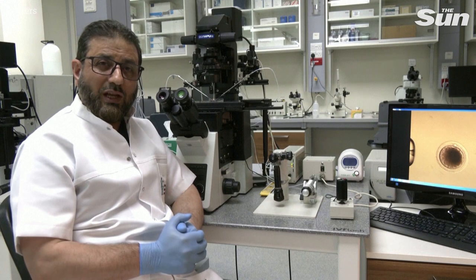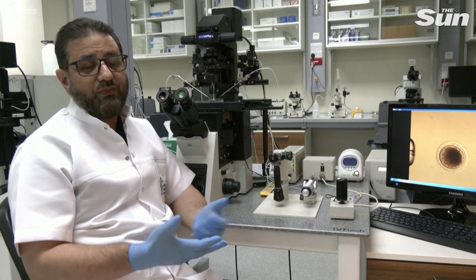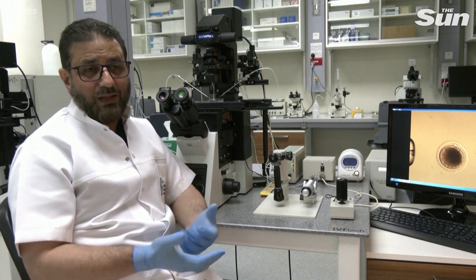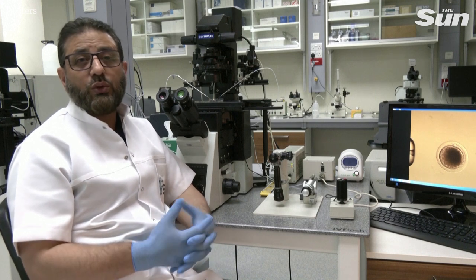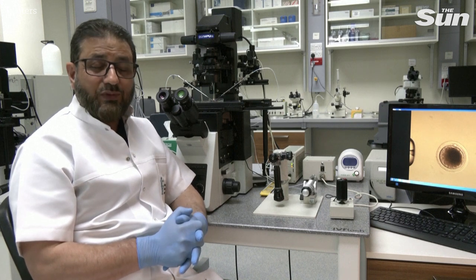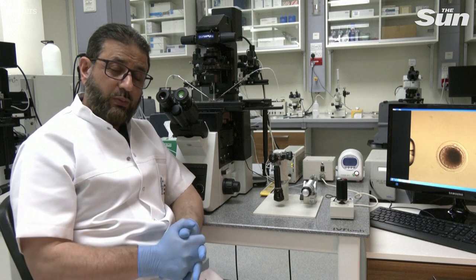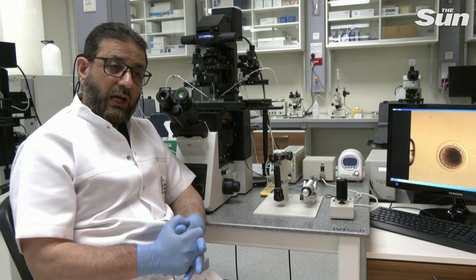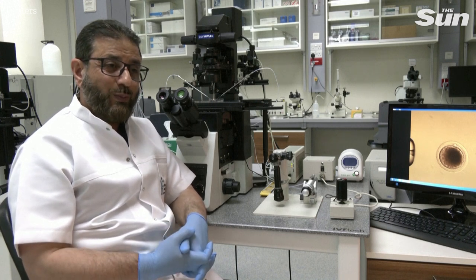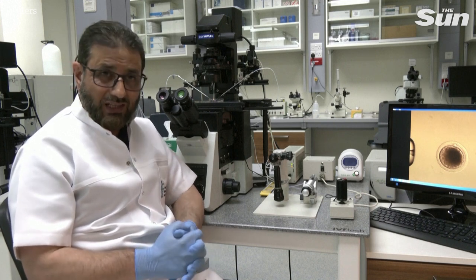In case of cloning, if we have 10 embryos, we get maybe one, or from 100 embryos we transfer, we can get 5 to 10 pregnancies, and sometimes maybe 3 to 6 babies born. So the efficiency rate is very low as compared to the normal reproduction, as compared to the normal multiple ovulation and embryo transfer. And it's also very time consuming, but it's worth it, because here we are producing the exact genetic copy of an animal, which is not possible in any other technique.